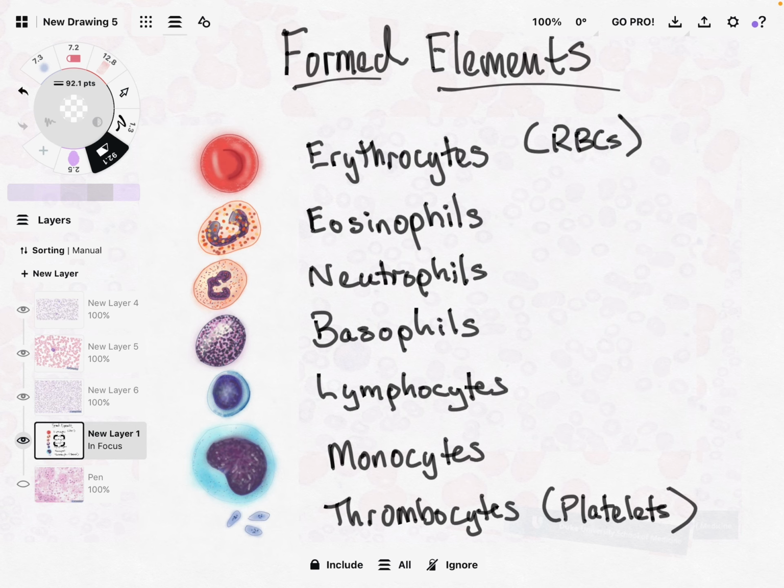So particularly, it will stain the nucleus a dark purple or a dark blue color. Eosin, on the other hand, tends to stain things that are more positive or eosinophilic, and it will stain things more of a reddish or a pinkish, or in some cases, maybe an orange color. All right, so we have these two contrasting colors. Hematoxylin staining basophilic substances dark blue or purple, and eosin staining eosinophilic things more of a pink, red, or even maybe an orange color.